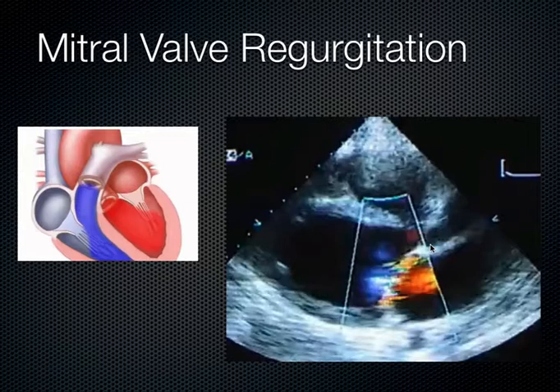Now, this is an example here of the parasternal long axis, just to demonstrate where that mitral valve is. One of the things you have to remember about Doppler, it's a little bit confusing initially, but you've got to commit this to memory, is that when you work with Doppler, you can't have the Doppler assessment at 90 degrees to the angle of the sound.